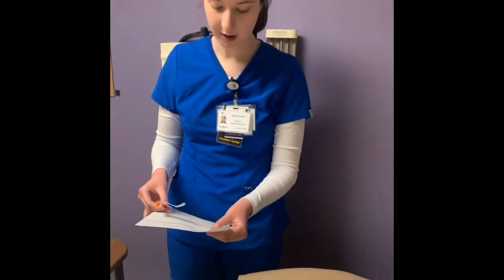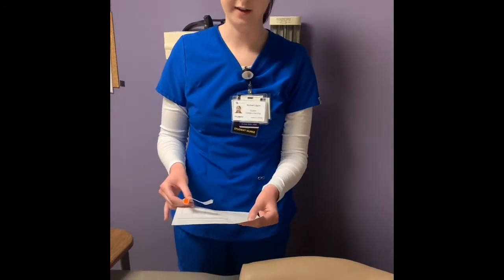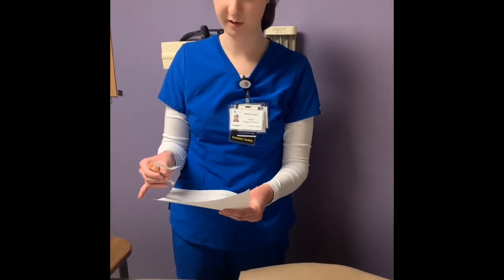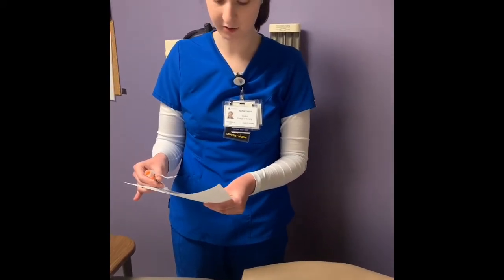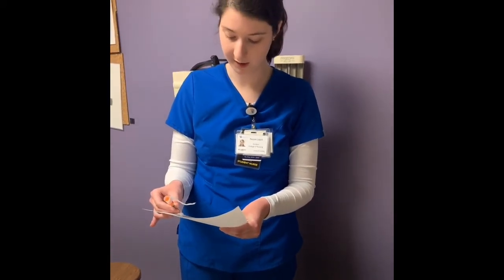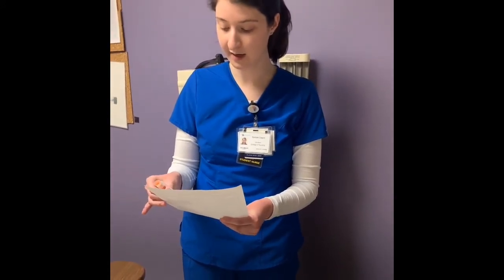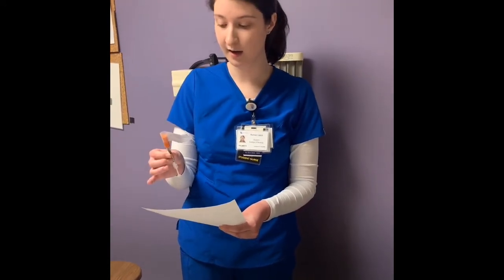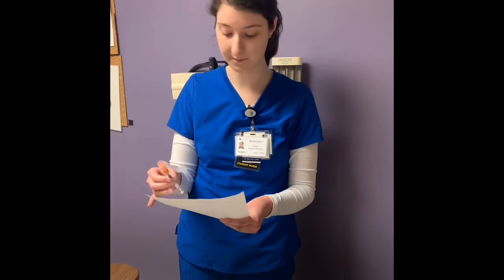So this order is for Carmen Guadalupe. Date of birth is 2/2 of 92. We have verified that this is the correct patient, and I have in my hand a medication that I have prepared for Carmen Guadalupe. The order states that this should be regular insulin at a concentration of 100 units per 1 milliliter to be delivered subcutaneously. In my hand, I have regular insulin at a concentration of 100 units per 1 milliliter in a syringe that has a needle attached to deliver this medication subcutaneously.